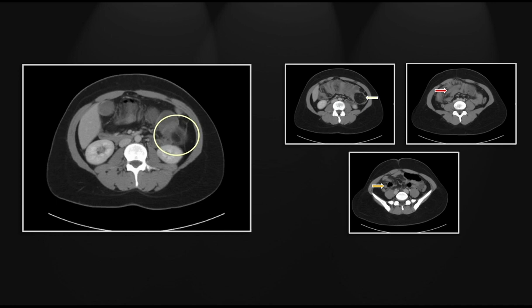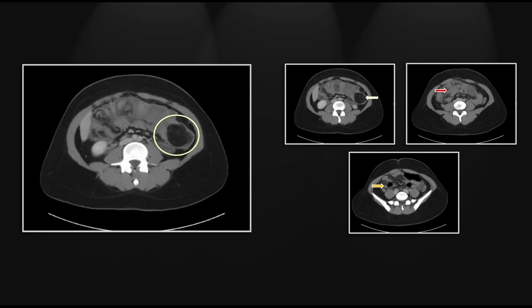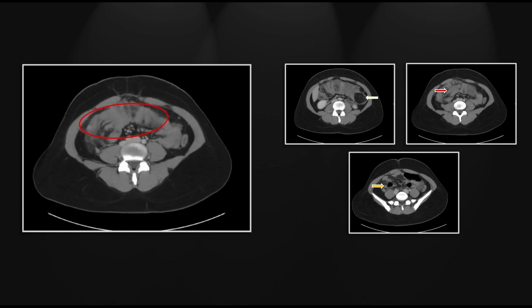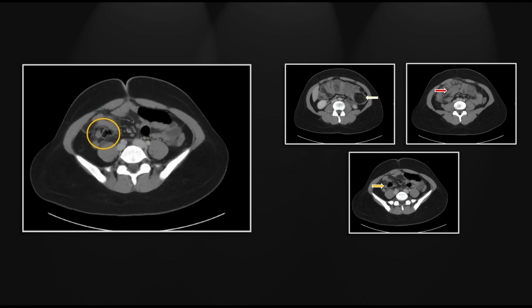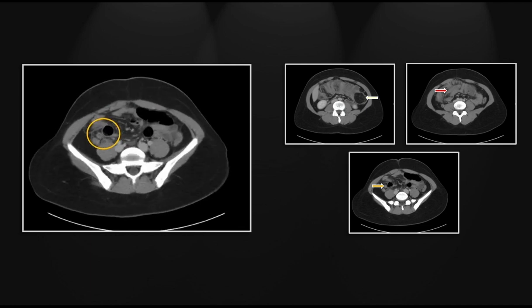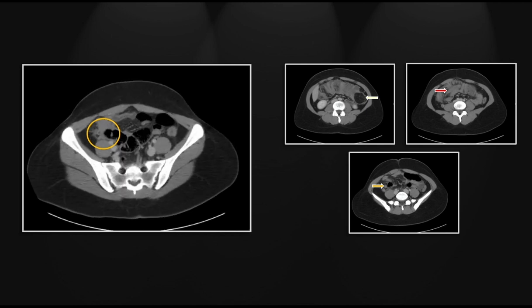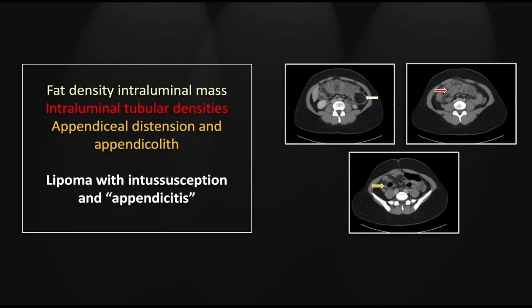There is that fat density. Here is the vascular pedicle and mesenteric fat of the intussusception. And here we'll see the appendix — dilated, thick-walled, and with an appendicolith — again meeting the criteria for acute appendicitis. Obviously, this patient may need surgery for the intussusception in any case. That is a lipoma with intussusception, a common lead point in adults, with secondary appendicitis.